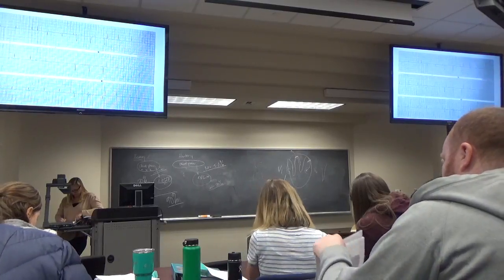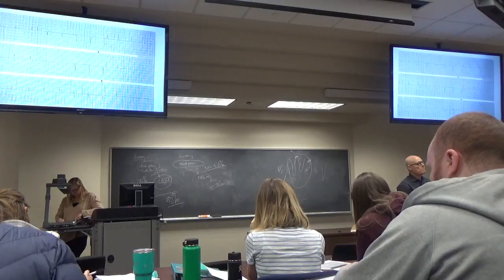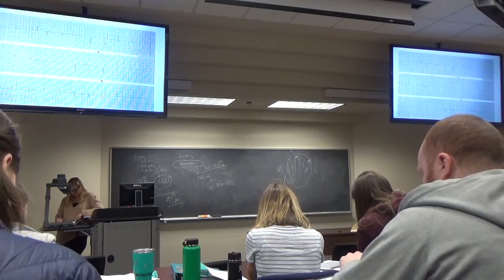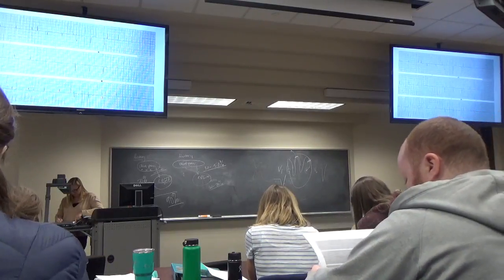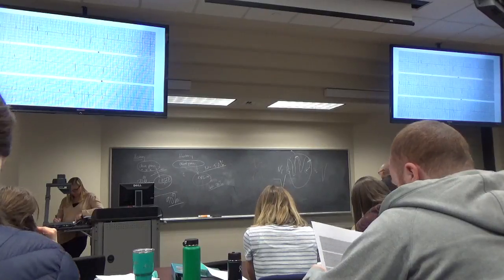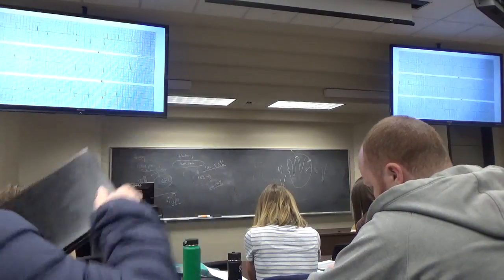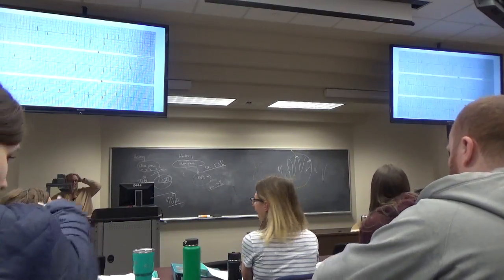Okay. I have a question. Yeah. So for the laterals, there's four boxes that go over the lateral four leads. So let's say just one of the boxes had inverted T waves, but the other one didn't. Is that good enough to call it ischemia? Usually not. So it would be like half of them. Well, I don't have a rule for that.